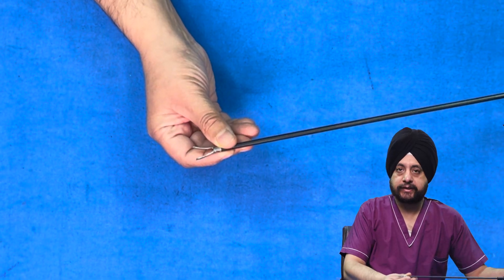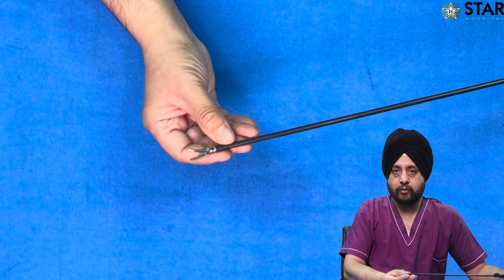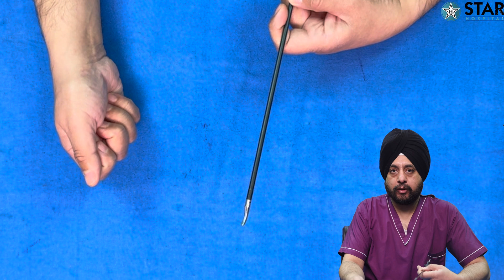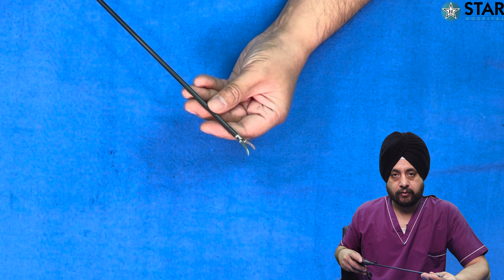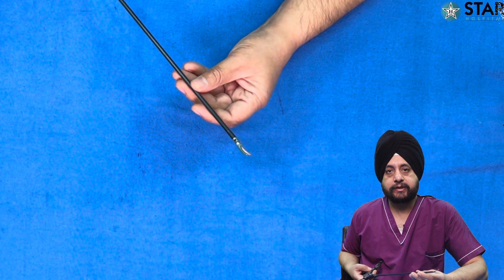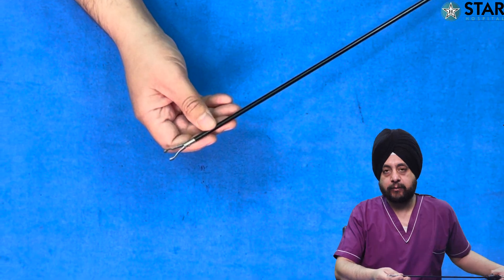This one is known as the Maryland — it's a curved dissector with a pointed but blunt tip that curves as we go towards the tip. It is usually used in the right hand of the surgeon and can also be used during suturing in the left hand when using a needle holder in the right. It is one of the most commonly used dissectors in laparoscopic surgery. The tapering tip allows fine dissection — you can go close to tissues, dissect, enter crevices, and dissect structures like going around the cystic artery or vessel.